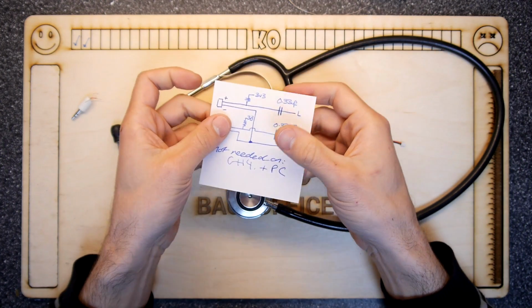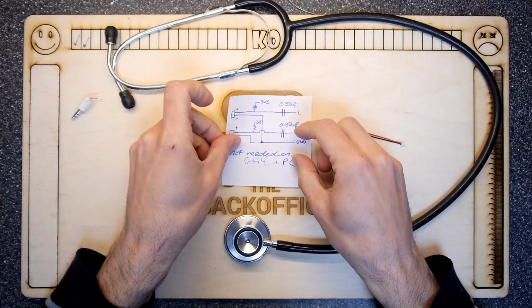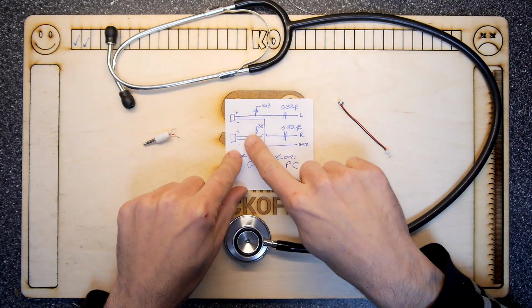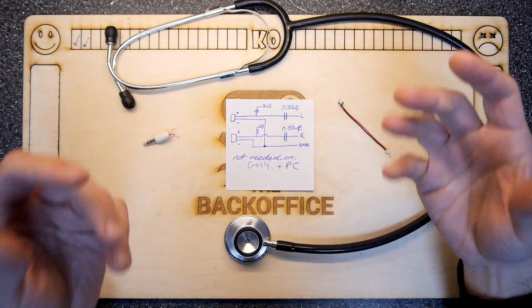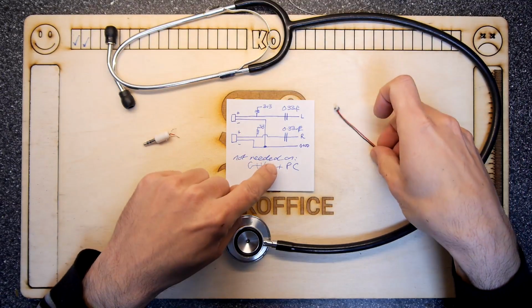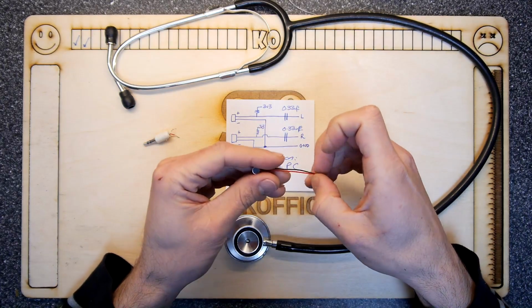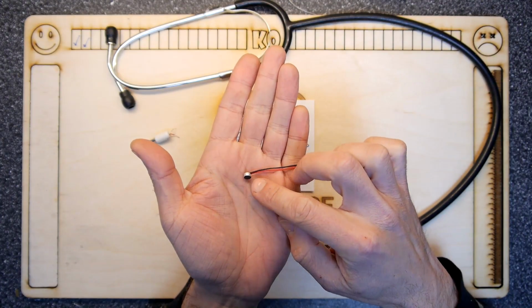Now, there is a complexity here, and you don't have to worry too much about it if you're lucky, and I shall just show you how to test this. These microphones require power. You can see here's a stereo circuit, and if you look at one of my previous videos, I've actually made my own microphone, and you can see how I did that. This project is very similar to that. So if your computer doesn't actually output power, you will need to power the microphone. And it's only about 2 volts or 3 volts, whatever your microphone specification is.